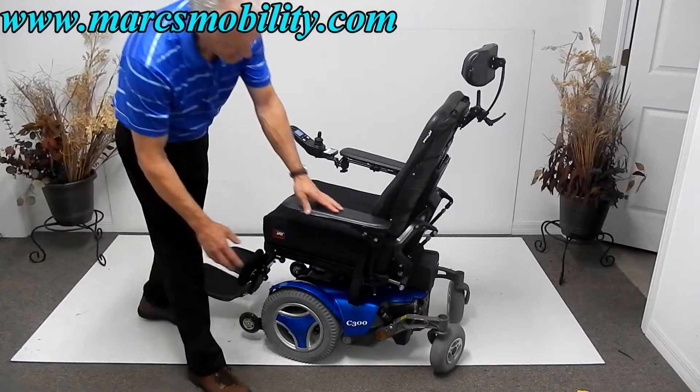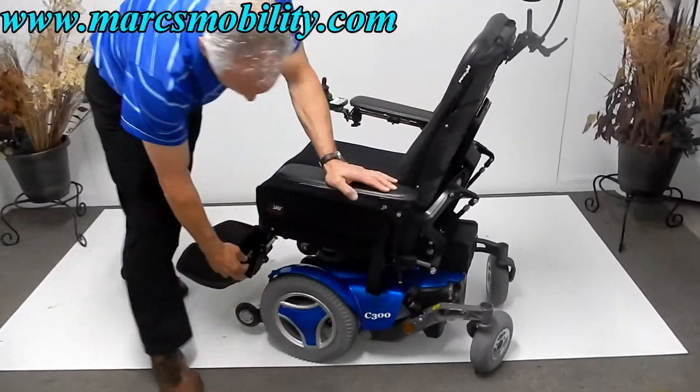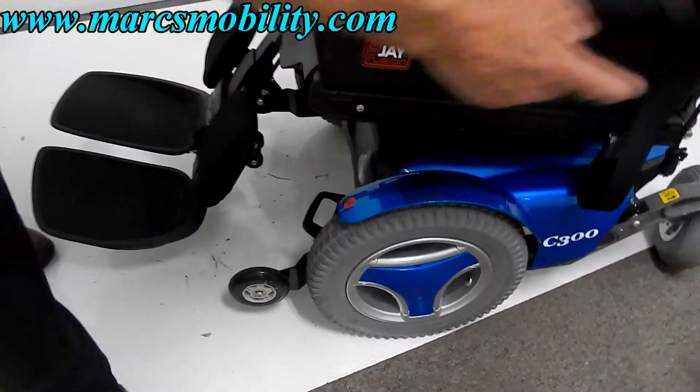You've got anchor points for tying this chair down to your lift. There's an anchor point here, one in the front on both sides, and one in the back on both sides.